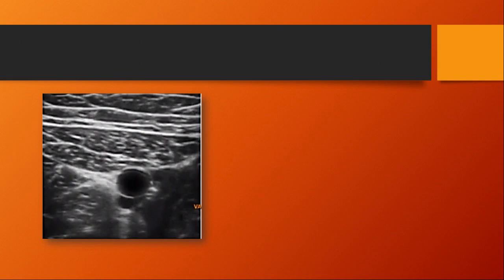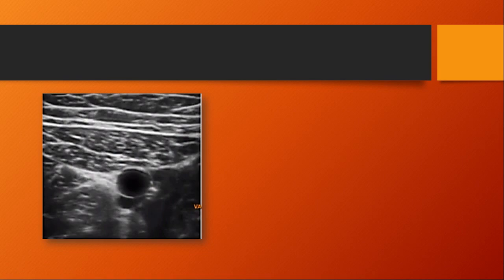When the probe is placed on the medial aspect of the front of the thigh, the first target is the anechoic pulsatile structure — the femoral artery. The sartorius appears as a board-shaped muscle with a peculiar view. The nerve to vastus medialis lies anterolaterally to the femoral artery and looks hyperechoic, though it is not always easy to identify. You need to find the nerve to vastus medialis and the saphenous nerve.